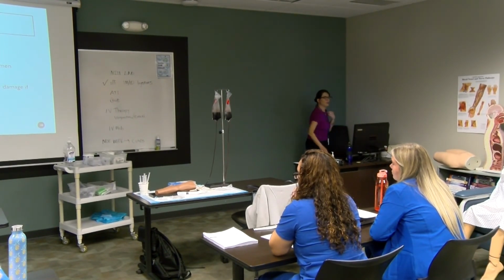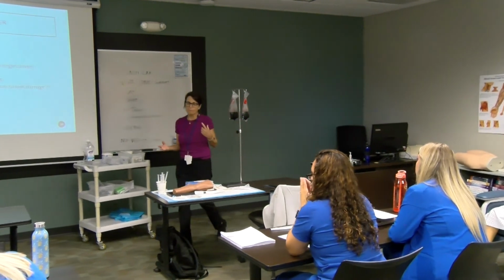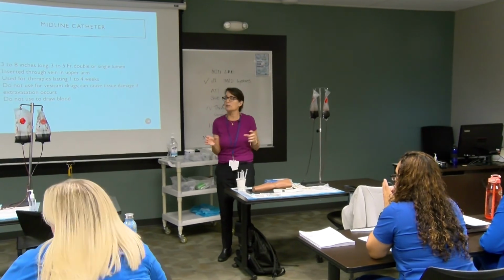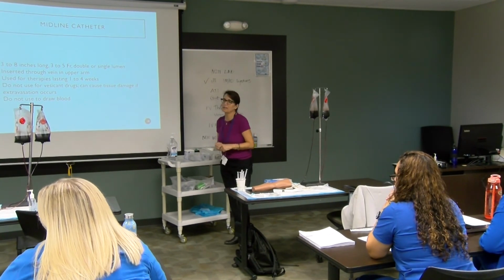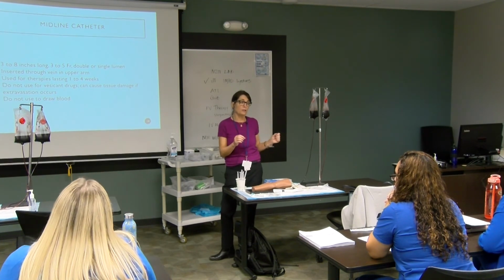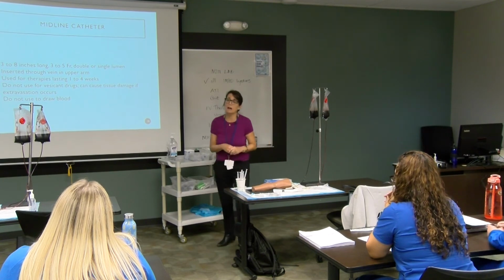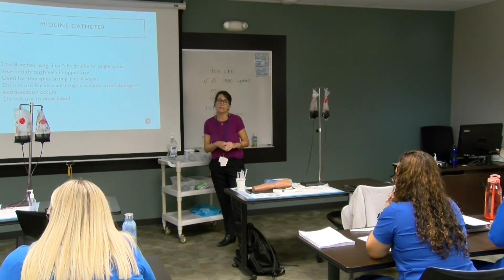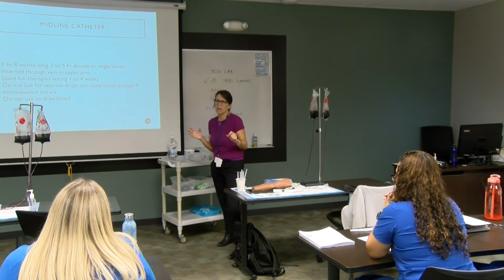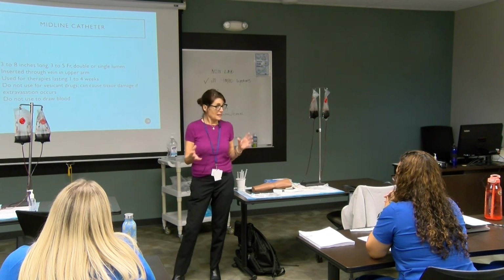The midline catheter, I just want you to be aware of that. The midline catheter is a peripheral catheter that you may see in some hospitals. The advantage of a midline catheter is it can stay in place for longer than the peripheral catheter. Does anyone remember from the ATI how long these peripheral catheters are good for? 3 to 4 days, typically.